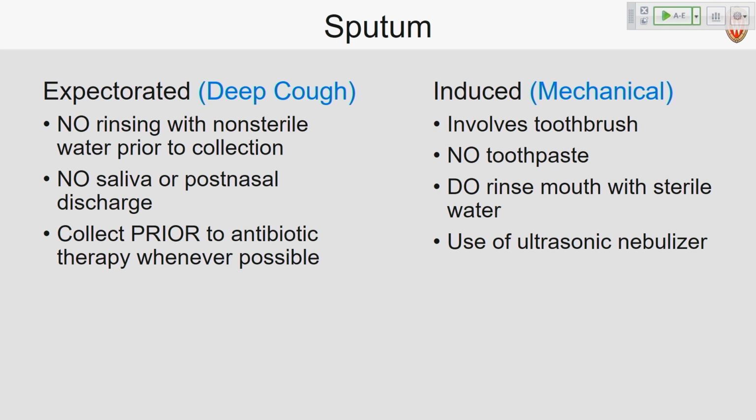Contrasting that with induced sputum, that's really more of a mechanically collected sputum, so it can involve a toothbrush. It does not use toothpaste, but you would see rinsing of the mouth with sterile water in a situation like that, and oftentimes use of an ultrasonic nebulizer.